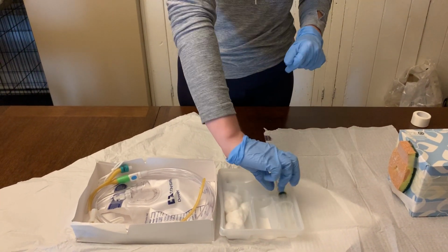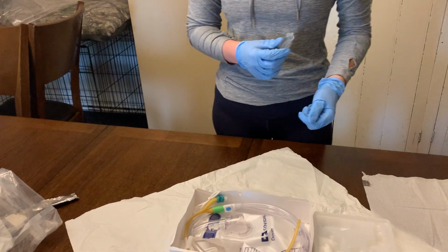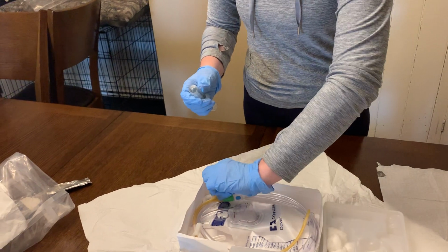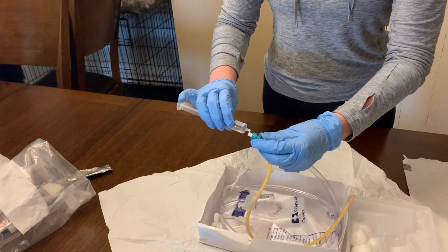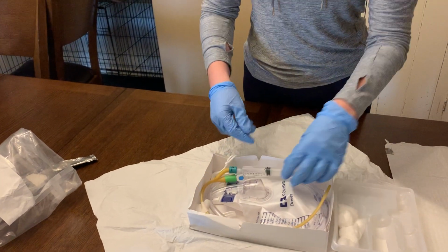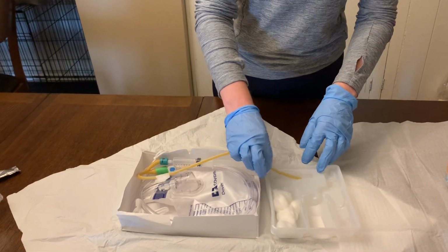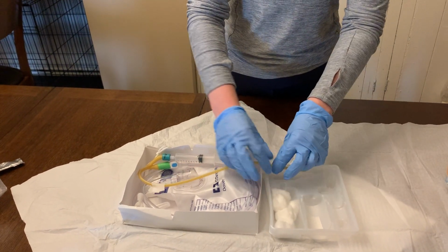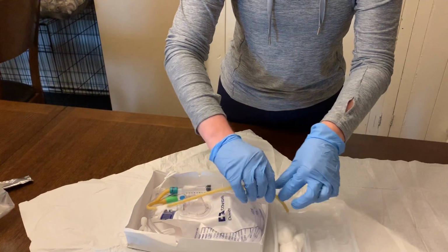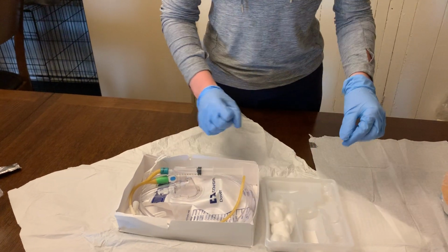Okay, so now that I've done that, I'm gonna take my syringe of fluid, and that would have landed in the trash, hopefully. And then I'm going to connect this syringe to the tubing. And I will also lubricate the tip of the catheter, and then I will leave it rest in the tray. And then I can just place it back into the sterile tray.